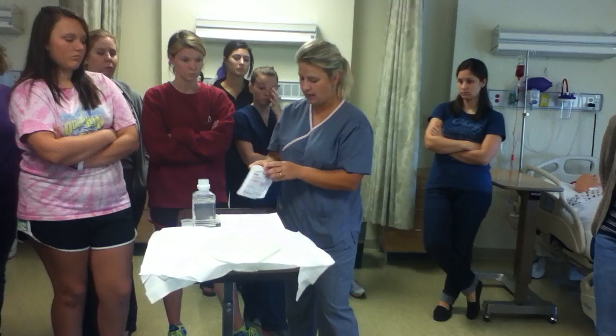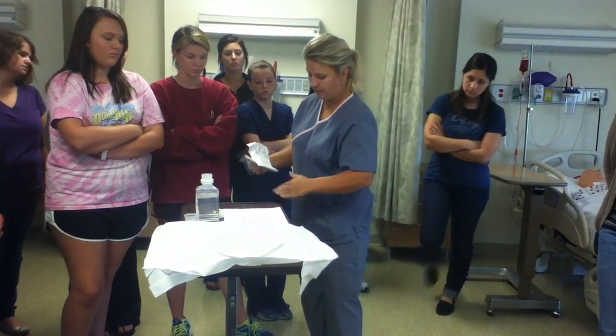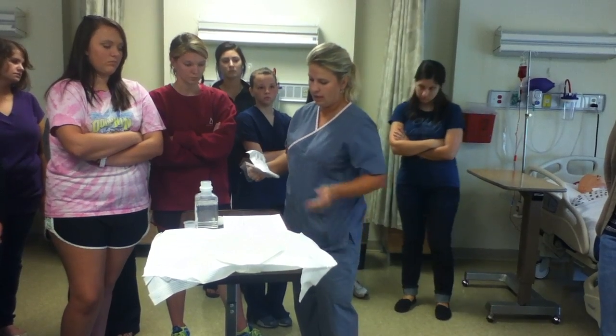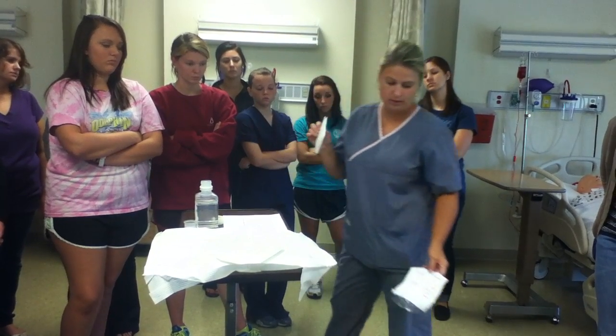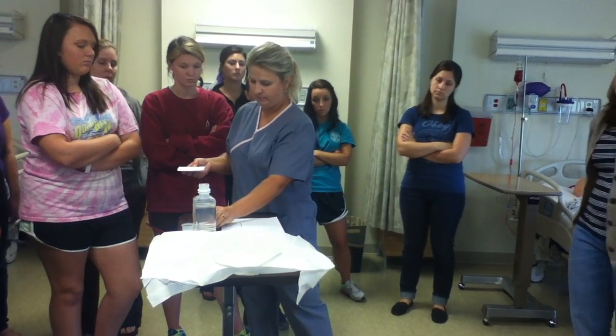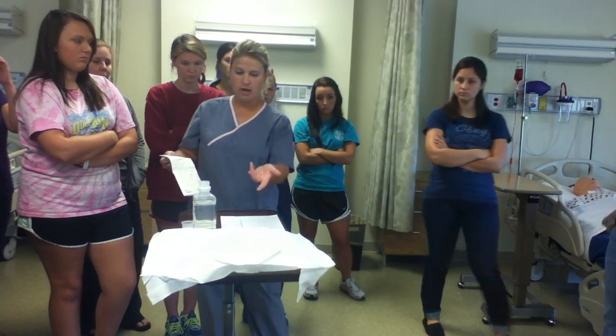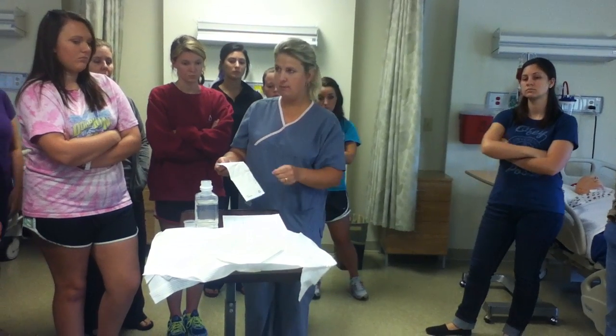Now, I am going to put on one sterile glove, and I got some water here. Please know, you guys, if you get water on a sterile field, it is contaminated. So I'm going to come over here. Now I can move around. I still can see my sterile field. I can still see my patient.